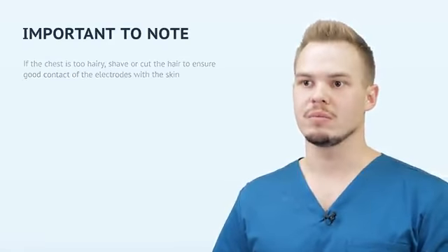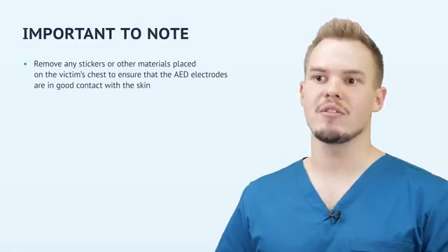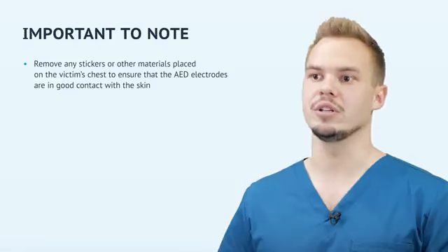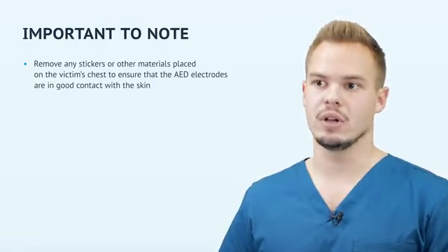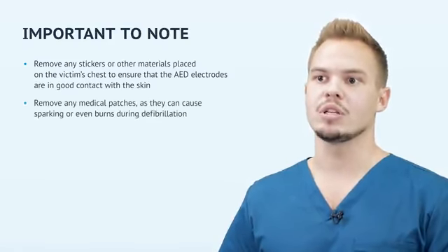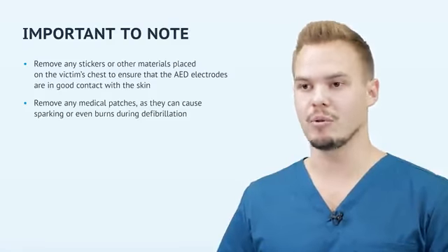Watch the stickers. Remove any stickers or other material placed on the victim's chest to ensure that AED electrodes are in good contact with the skin. In some patients, there can be medical patches on the chest. They must be removed as they can cause sparking or even burns during defibrillation.